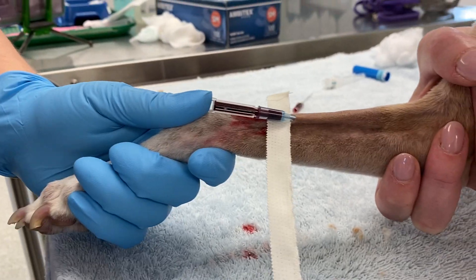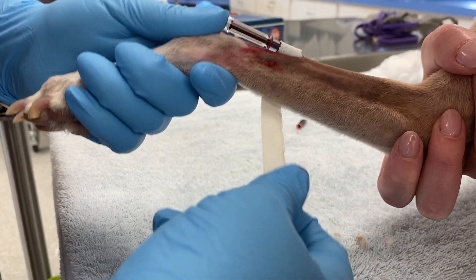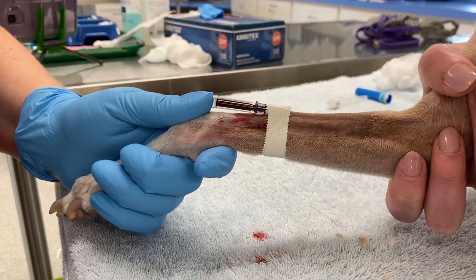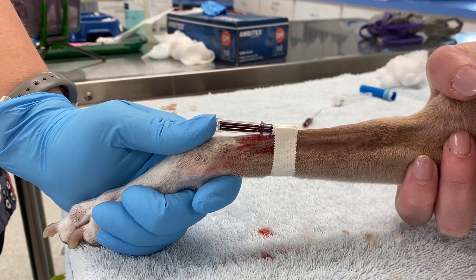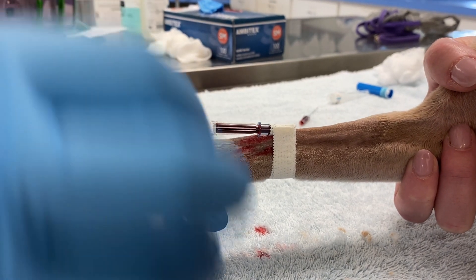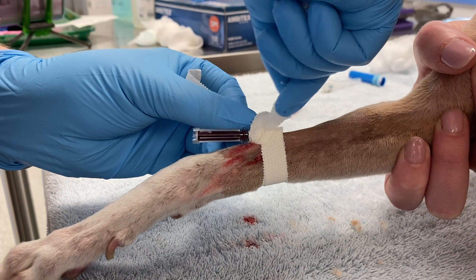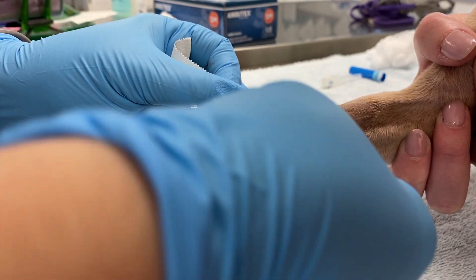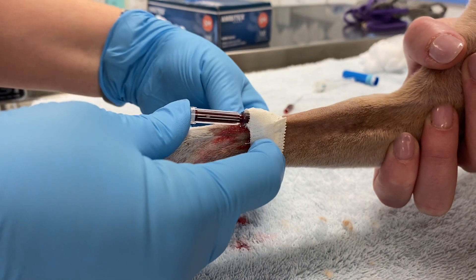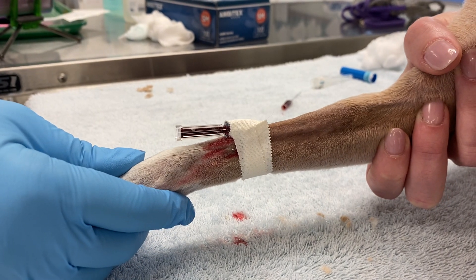I slid the skinny tape underneath, flipped it up and over, wrapped it around the bottom, and back over the top. This first piece of tape will secure the catheter to the leg. Your next piece of tape will slide sticky side up — it's a skinny piece — up underneath, criss-cross over the top, and bring the other side over the top. I am trying to move my hands a little bit so they're out of the way so that you can see.